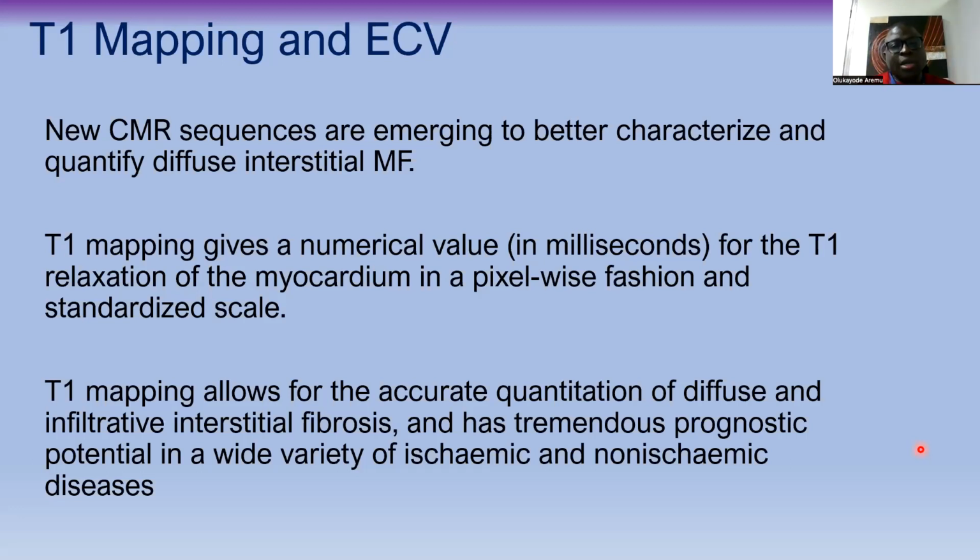Yes, LGE can show them, but it is so scattered. You can see the pattern we saw in myocarditis, very diffuse. Almost like you can just see those dots there. But if you want to quantify them, that is where or when you use T1 mapping.